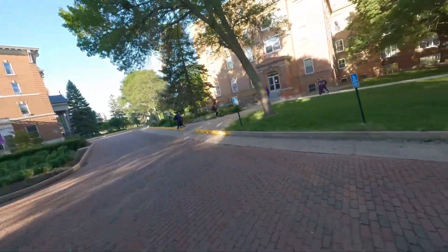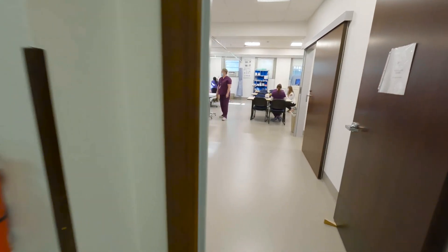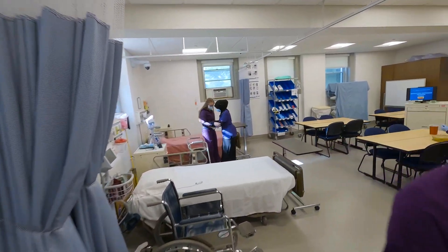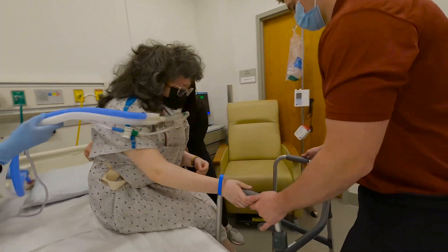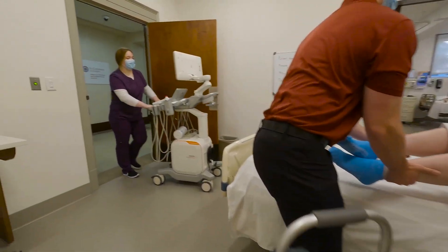How did your assignment go last night? That is my favorite. Does this feel okay? Looks good. Are you having any pain? On the count of three. Drop 25 units. When you feel the bed, sit down. Legs up. I'm here with ultrasound.